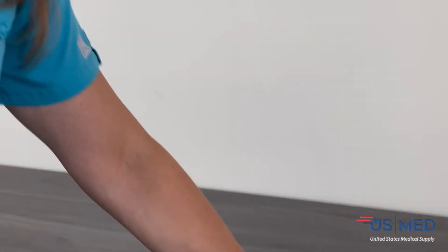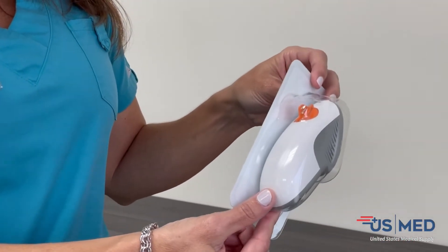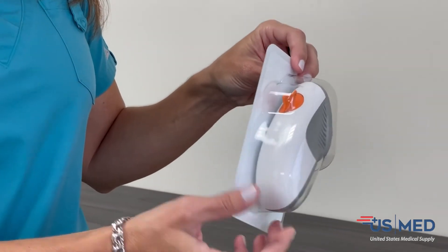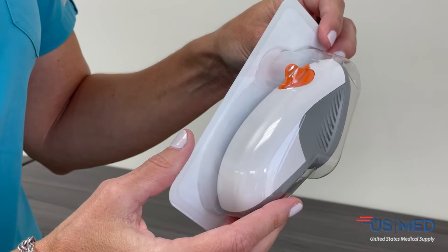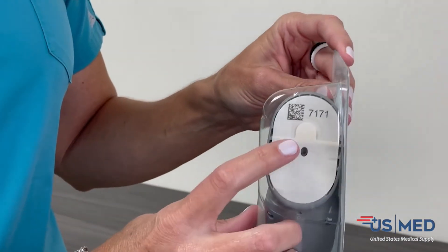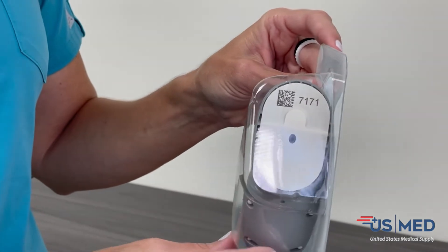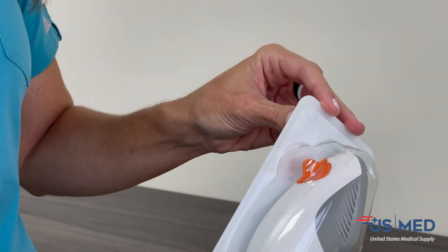Then we move on to the sensor applicator, so you have an idea of what it looks like. This is just the applicator — you can see it's a one-button insertion. Each applicator is going to have a sensor code on it that must be entered into the receiver as you're setting up the insertion.